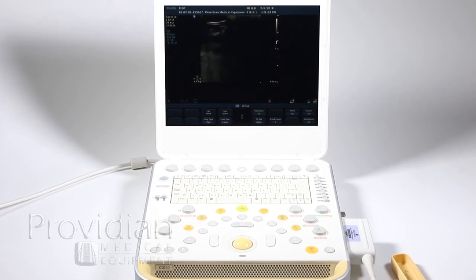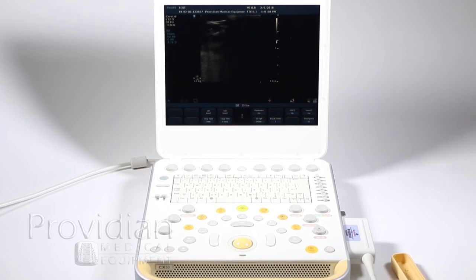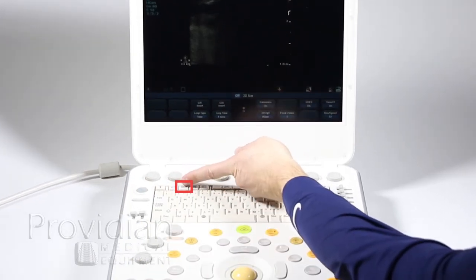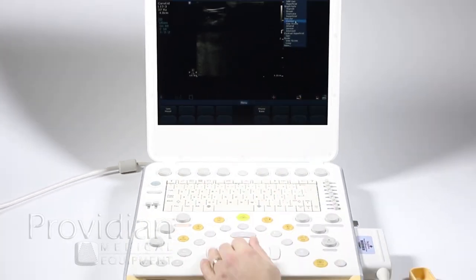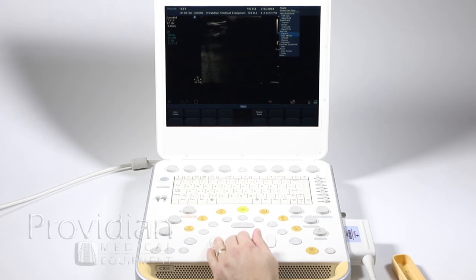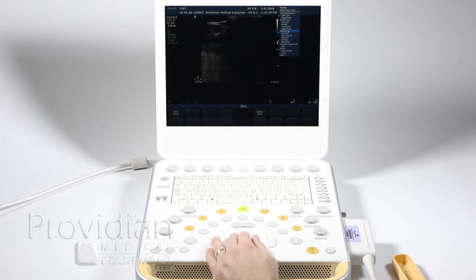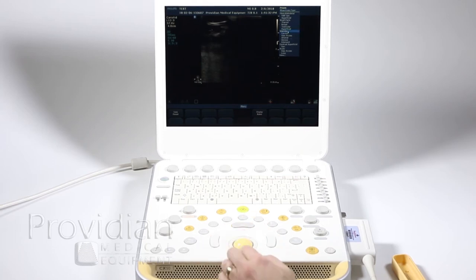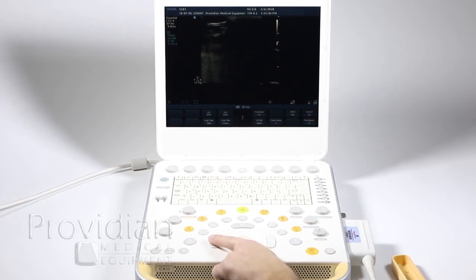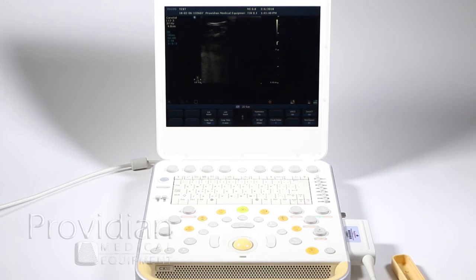Now that you have your patient ID entered, you're first going to want to select your probe preset. These are imaging presets — it looks like two folders or a folder and a piece of paper. You click that and get all these selections. These presets optimize the image including depth, focal zones, dynamic range, and gray maps for what you're trying to do. I'll select carotid and hit the set key, and it will begin my carotid exam.